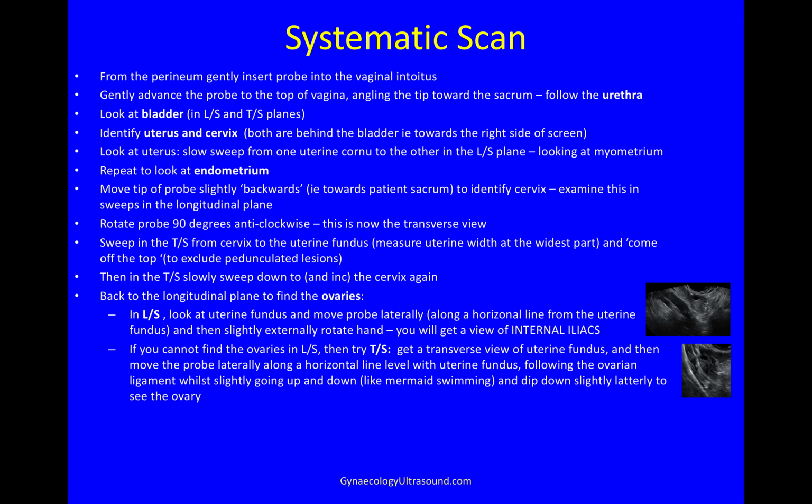And this is a view that you would get of the ovary seen in the transverse plane. Sometimes you can see a circle of the internal iliac vein, but you can't always. So there's no landmarks to see.